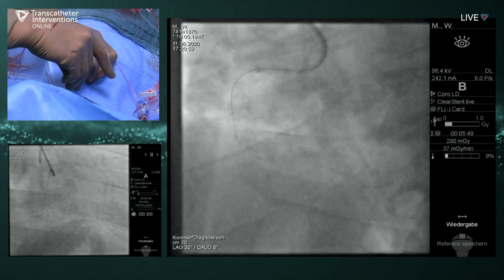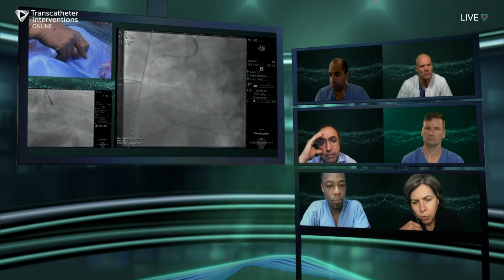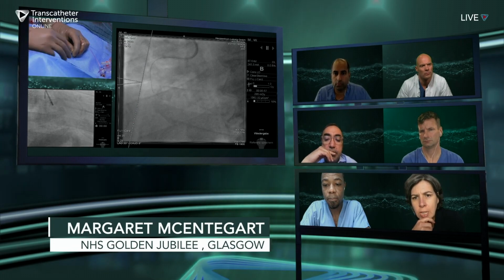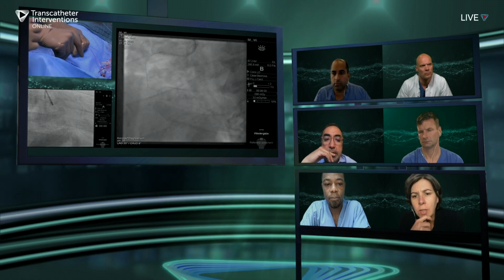Yeah, that's a good comment about the retrograde system. I see you have 6 French for retrogrades, which obviously you can do, retrograde 6 French, but it can make your life quite difficult. I would usually use a 7 if I think I'm going to use a retrograde bailout.